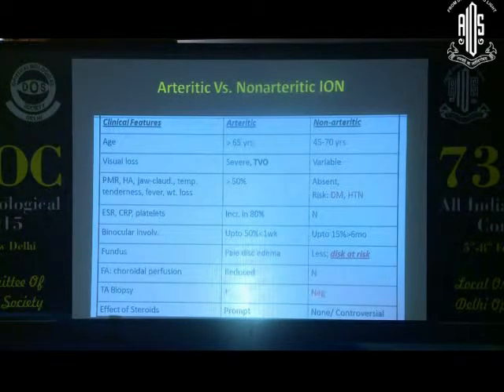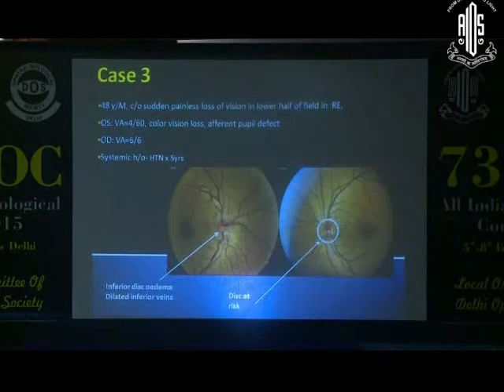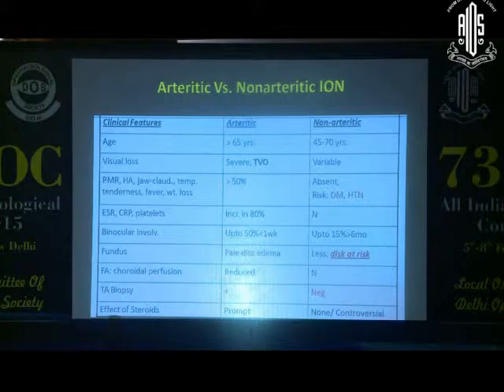So the diagnosis is quite clear. You can see on fundus photograph there is inferior disc edema, and there are some dilated inferior veins that suggest the diagnosis of ischemic AION. Now we have to differentiate the non-arteritic from the arteritic ischemic AION.